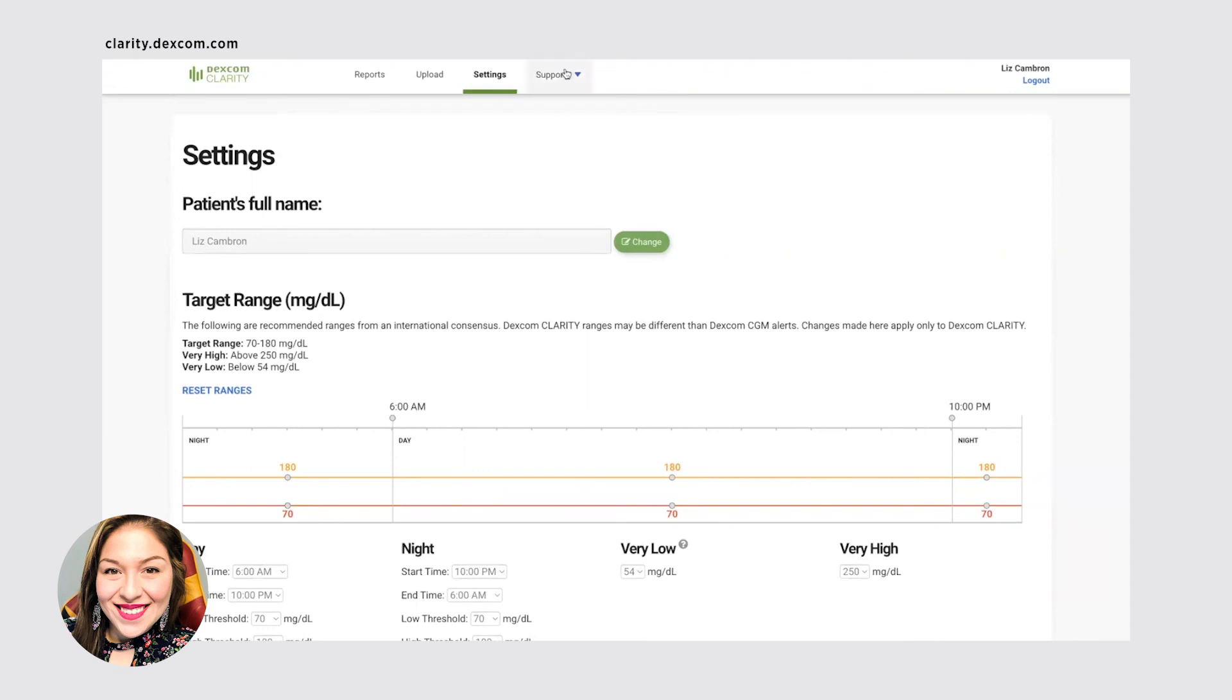And last but not least your support. So if you need help with uploading your data or understanding it and looking through, or even logging in, this is a great way to go ahead and find whatever information or help that you need.